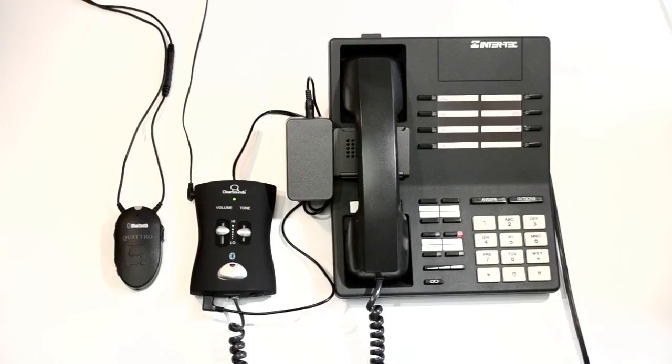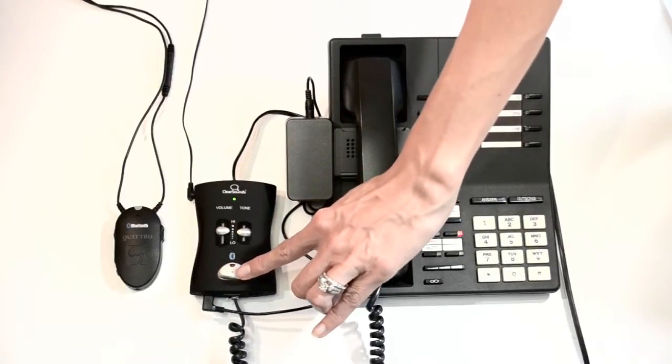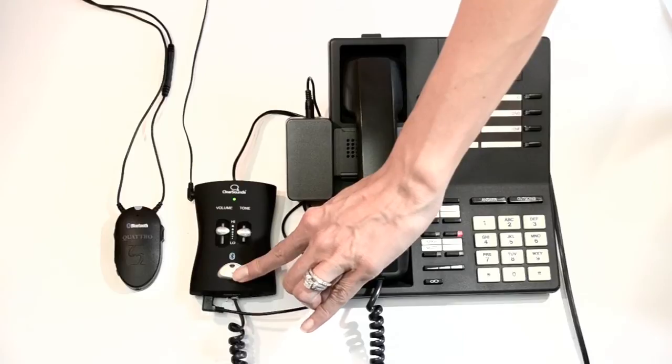Make sure you have your Bluetooth listening device within 3 feet of the QH2 hub. On the hub, press and hold the multifunction button until the blue and red light flashes.